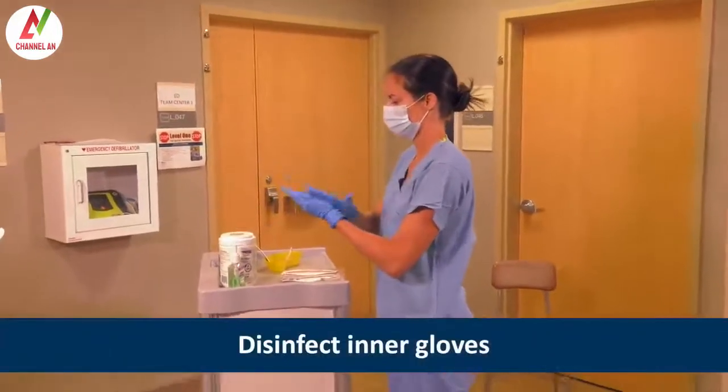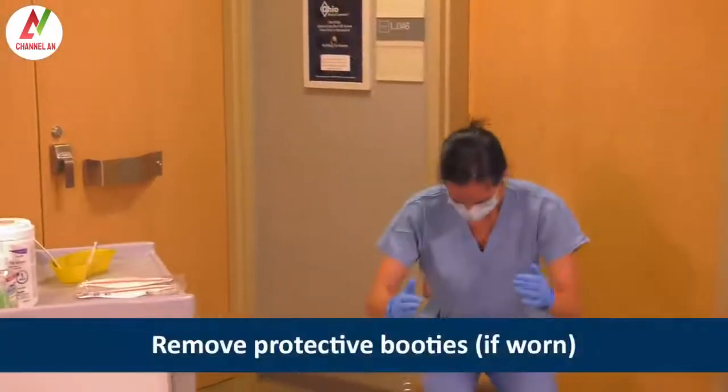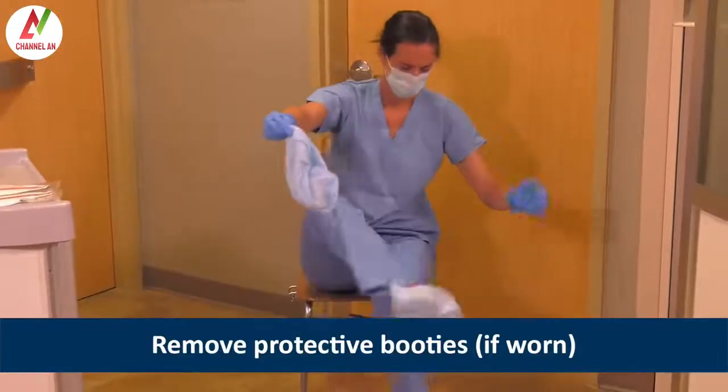Heather disinfects the inner gloves and removes booties if worn. She sits on a clean surface to avoid contaminating her pant legs.